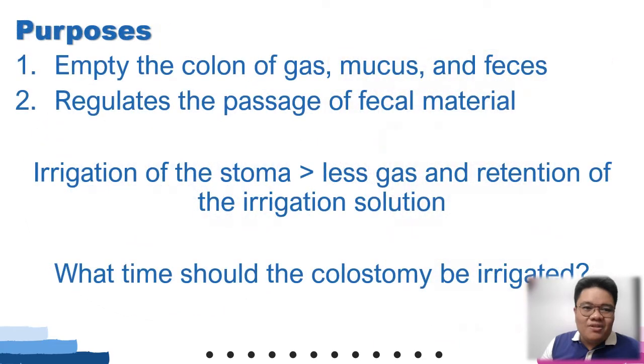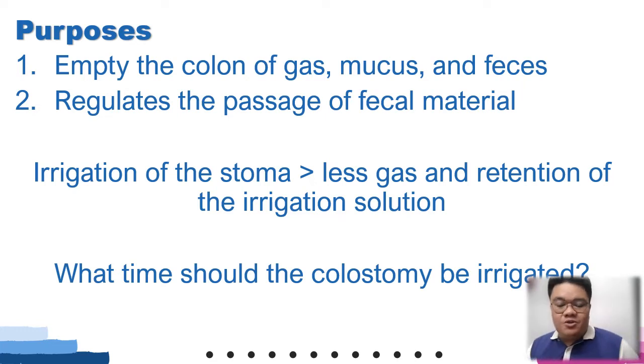Now, what are the purposes of your colostomy? Class, your colostomy is intended to empty the colon of the gas, the mucus, and the feces. It would also regulate the passage of fecal material. That means at times your patient would feel uncomfortable doing it in public because imagine, something is hanging on your abdomen.